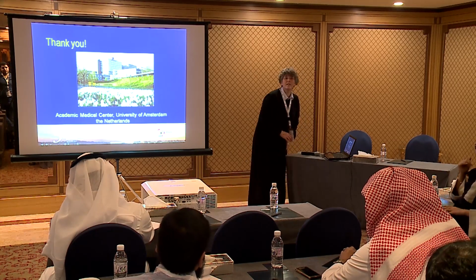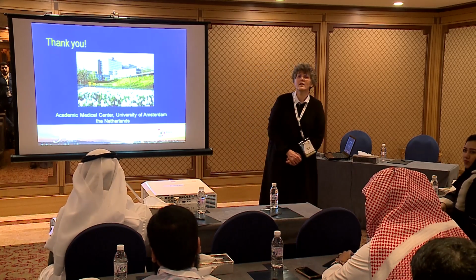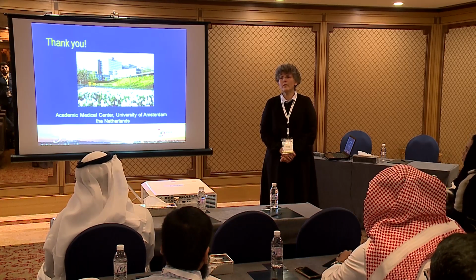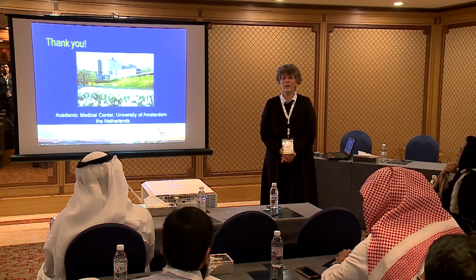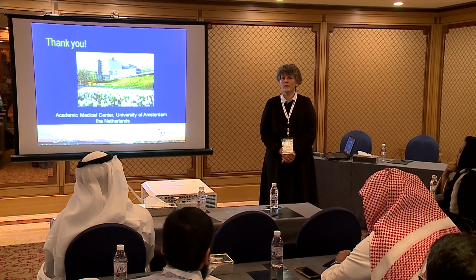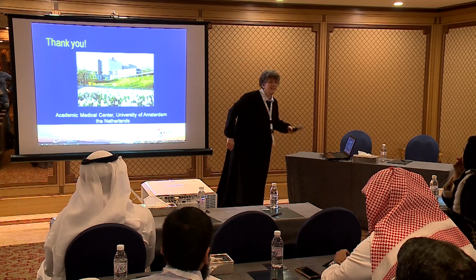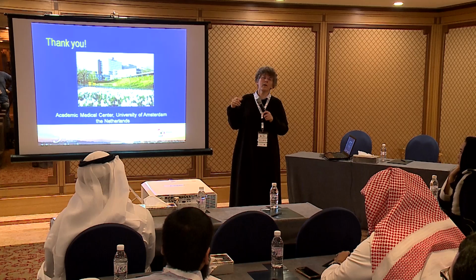Excuse me? Should we monitor the machine yearly or after 3-4 years, or according to the company? Well, for every machine there is a calibration program. Depending on your practice, you should calibrate your machine. We calibrate all our machines weekly. There are practices that do it daily. I think that's too much. But you have a calibration schedule, okay?